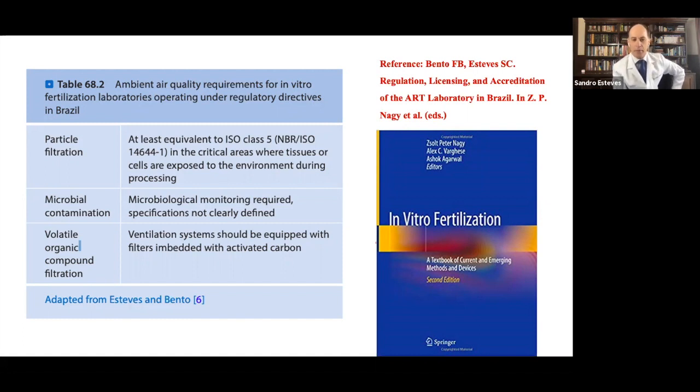Unlike the European directive, I would like to call your attention that in our directive, it's mandatory to have air quality control related to volatile organic compounds. So not only air particles, but in our case, it's also mandatory to have control of VOCs within the ventilation system.